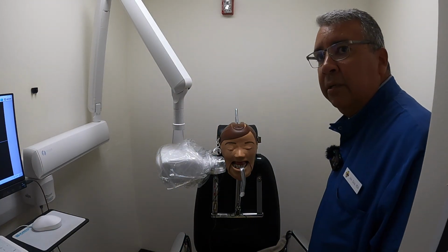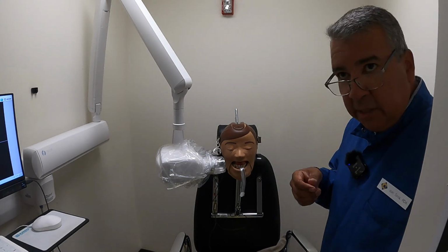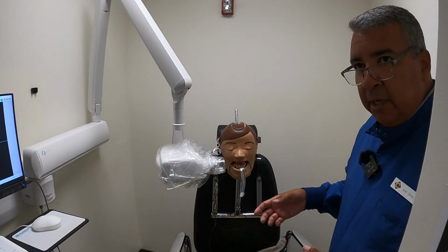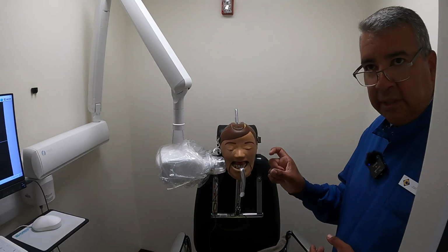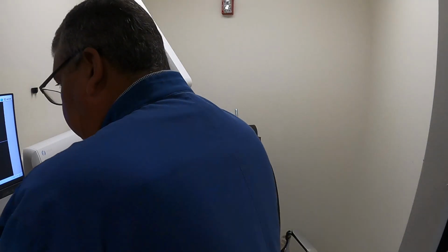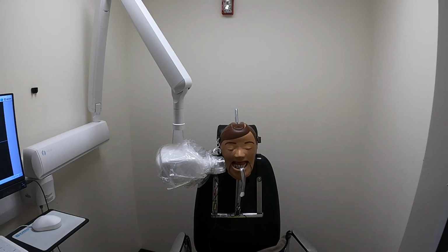To cover the whole first premolar or to the end of the first premolar? To the mesial of the first. So I kind of say the entire first premolar to cover. Now, they're not going to see the first premolar in that picture. All they're trying to do is center it at that point. That's all they're trying to do. So then I'm going to head on back over here, press that button, and it will then show up on the screen.